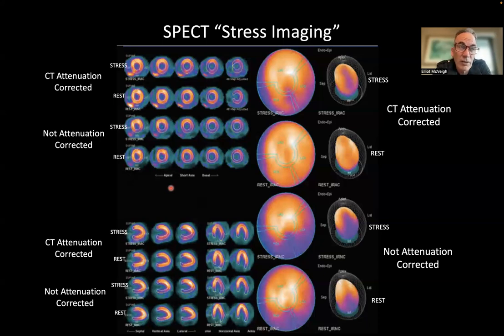So you can imagine how it goes, right? Your line integral from a source position basically takes you through different tissues, which you then have to model in terms of their spectral differences in attenuating radiation.